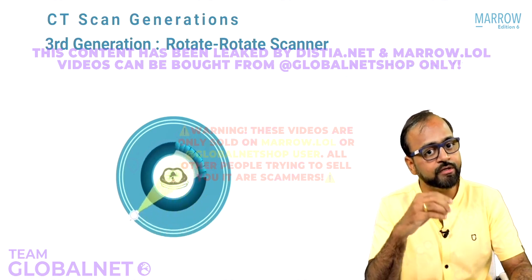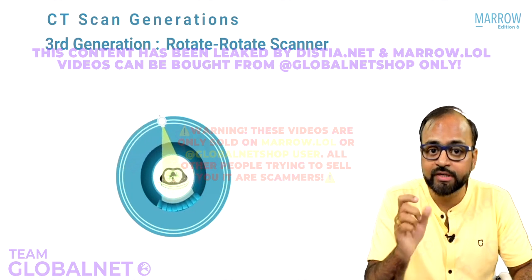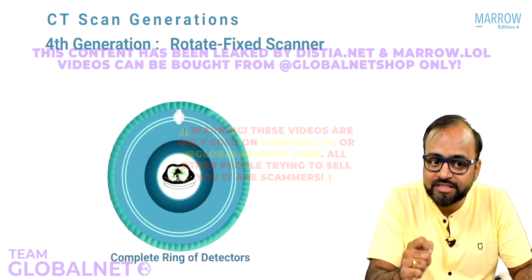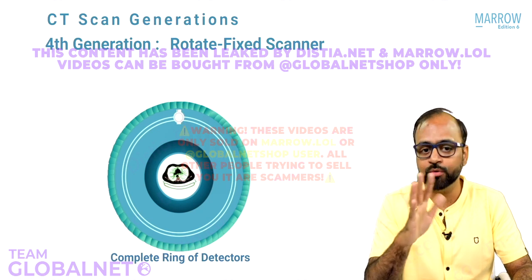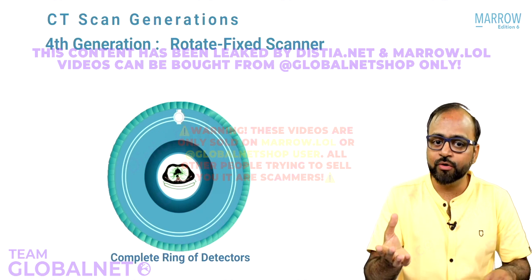Can we eliminate the rotation of detectors entirely so that they would remain stable for a long time? Yes, it was made possible by the development of the fourth generation CT scanner, which is called rotate fixed scanner. See, one rotation, of the detectors, they have eliminated. But how? See how beautifully they did it. See how simple the concept is.